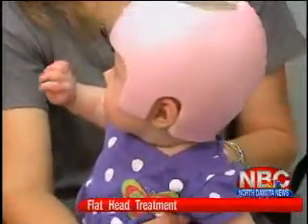For NBC North Dakota News, I'm Julie McDonald. Great Plains Rehab purchased the scanner software this summer. It also has a portable scanner for use when serving rural areas from Jamestown to Glendive.